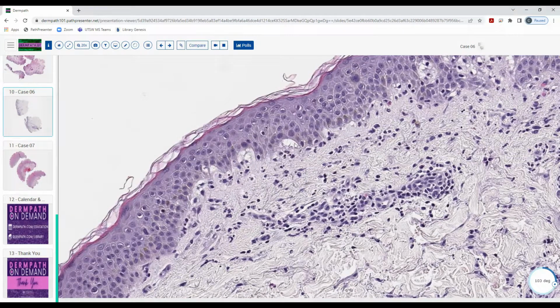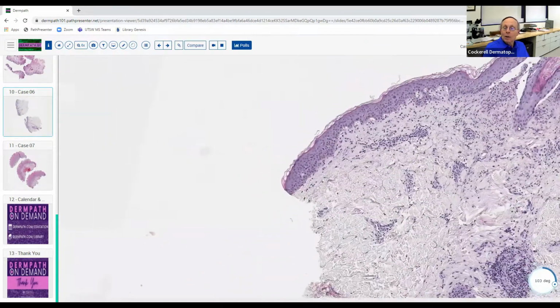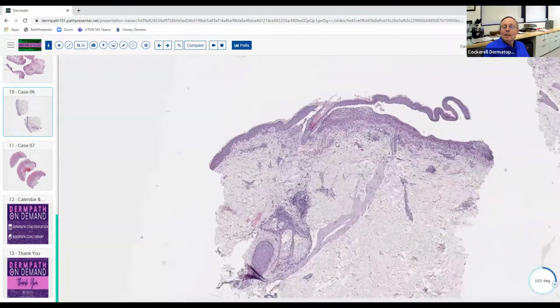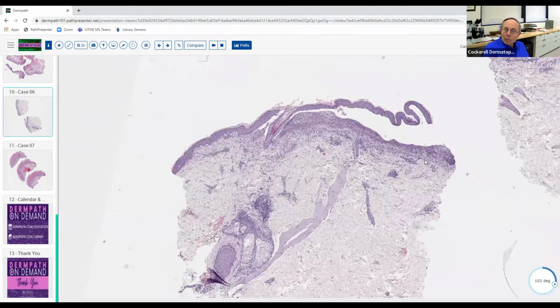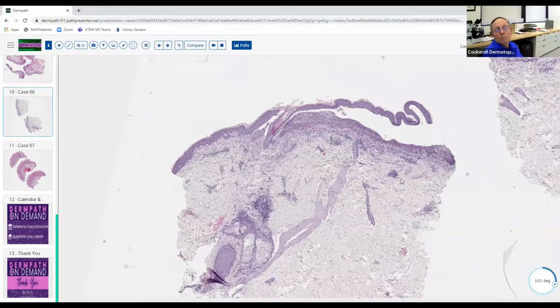Yes. So this is an early lesion, and then sometimes they actually go ahead and form blisters. So look at the size of this blister. It's probably a 4 millimeter punch. That's like a 2 millimeter blister. Okay, that makes sense. It's pretty small, you know, when you think about it. So they might have biopsied the edge of the blister, but it still can give you a blister of this size.